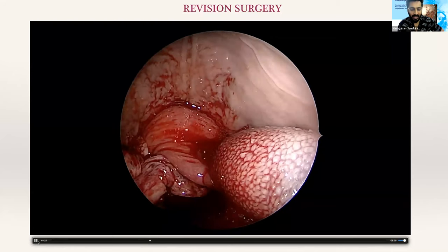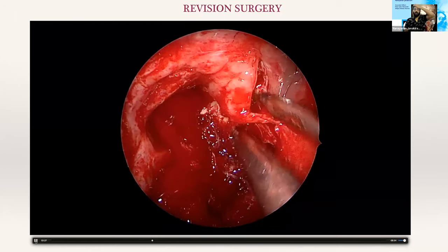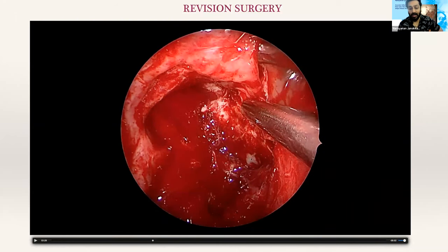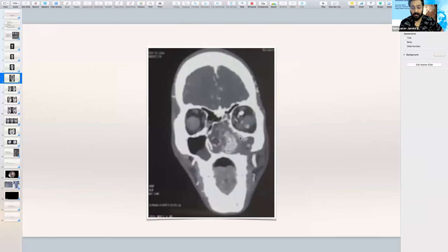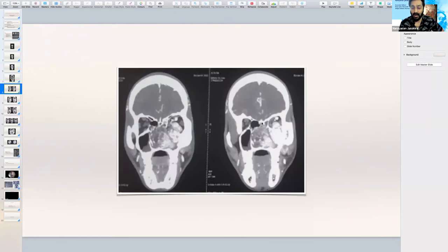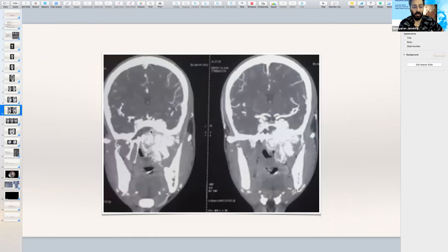So: first I used my finger to take off the non-vascular part; second I occluded the IMAX and removed the nasal part. Next step: to identify the infratemporal fossa part completely, I need the anatomy of the sphenoid sinus. I have to be careful about the carotid artery and the optic nerve. Going back to the scan — the posterior ethmoid on the right side is free. The sphenoid part has come out with the rolling technique.